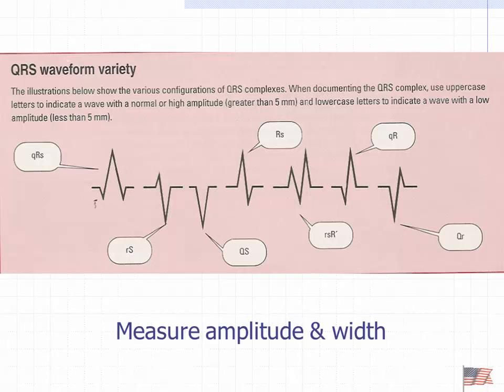So it's coming down the left bundle branch, and it runs into something where it's dead tissue. What does it do? Turns around and goes the other direction, now tries it again. As that turning around happens, that's what causes that. We call these rabbit ears. Not kidding. They look like bunny ears. And it's indicative of a bundle branch block.